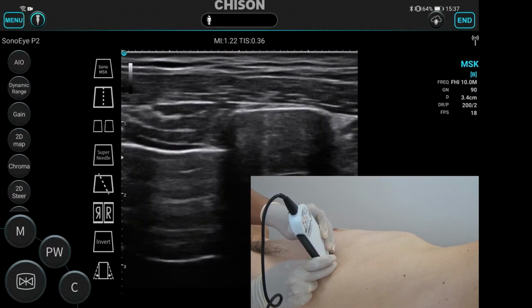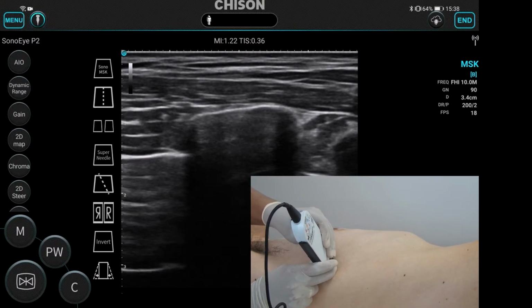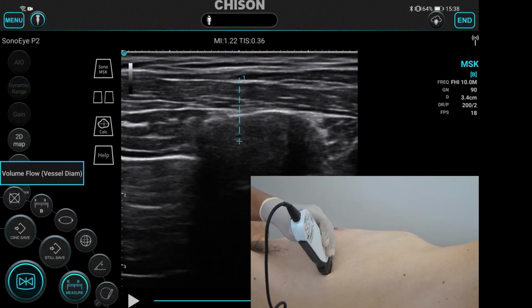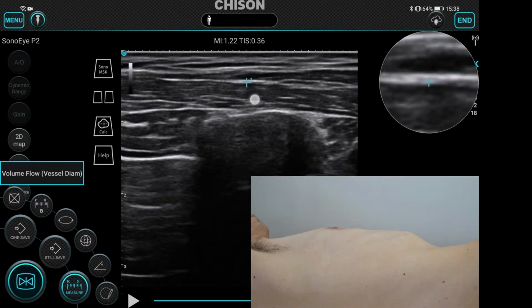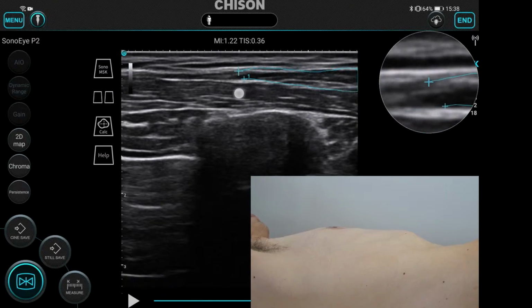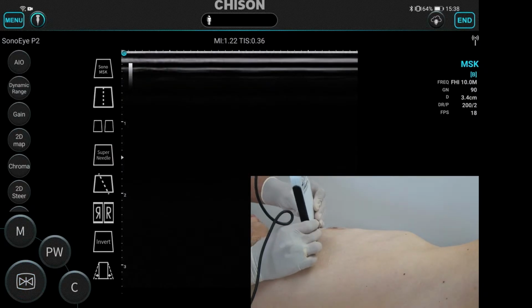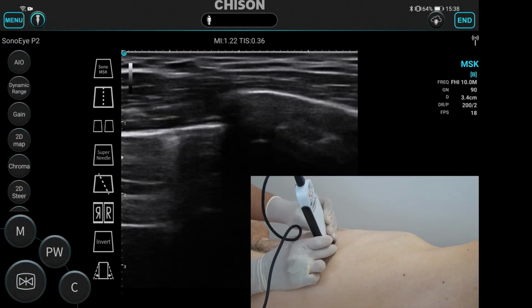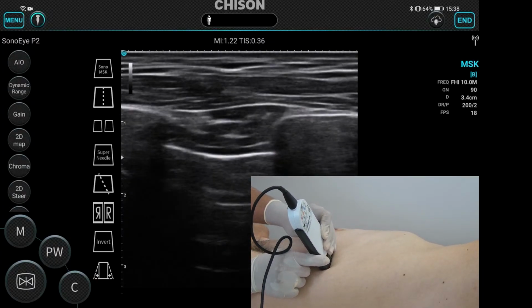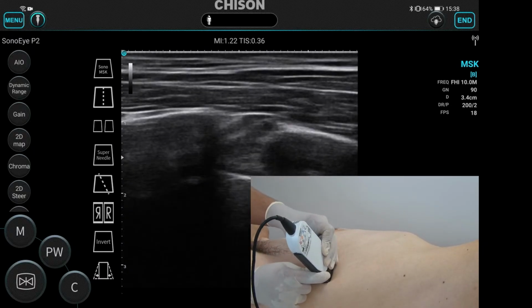So now from that position we will see a new muscle coming in on top of the serratus anterior. You freeze, I mark it for you first so that you understand better. This one over here is the latissimus dorsi. Okay, and now focus on this portion. We have the serratus anterior. We go behind, and we see the latissimus dorsi coming in from the top.